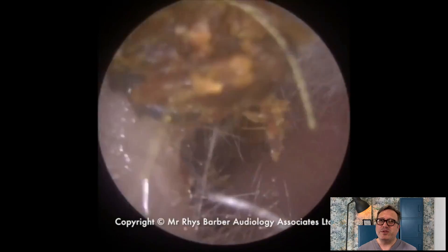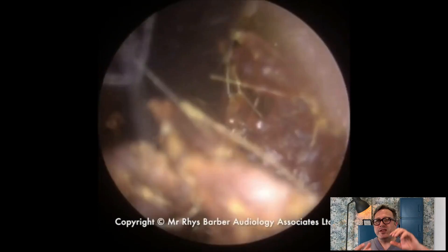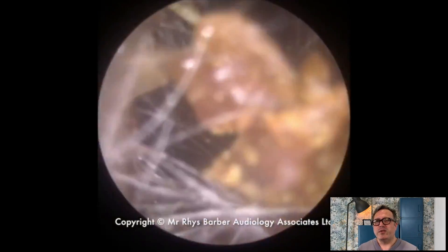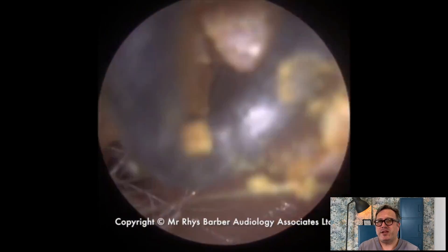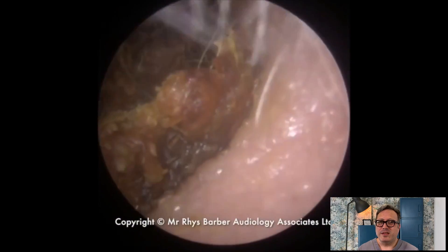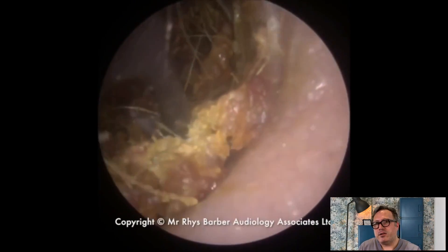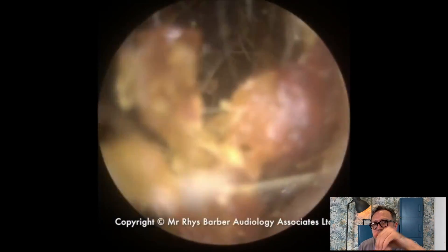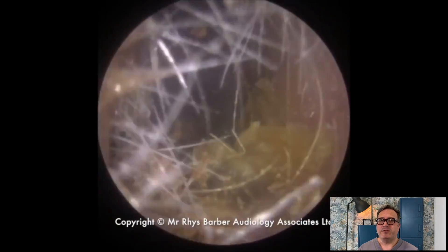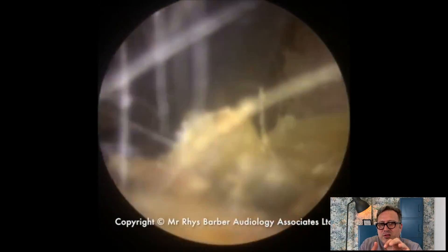It's pulled through and broken — you can see it crumbled into the Jobson horn — so not really the good grip we'd like to pull it out as one plug. I'm trying to work around the harder pieces around the outside edge to pull this forwards. You can see the ridge I'm trying to get behind. The outer section will normally be a little bit harder, so if you can get a good grip into that section you can bring the whole thing forwards.